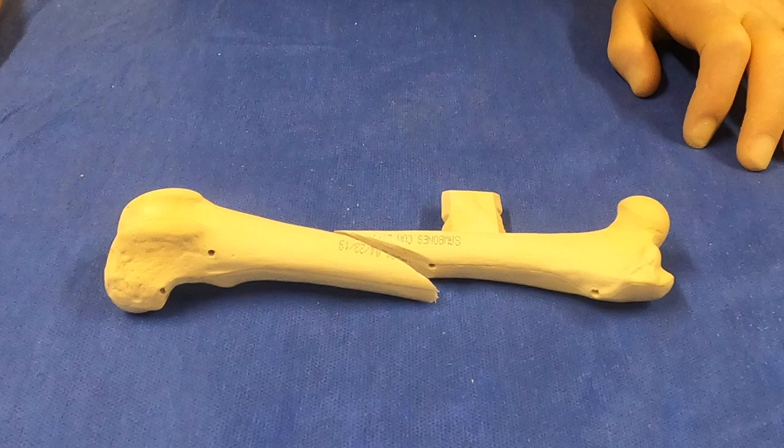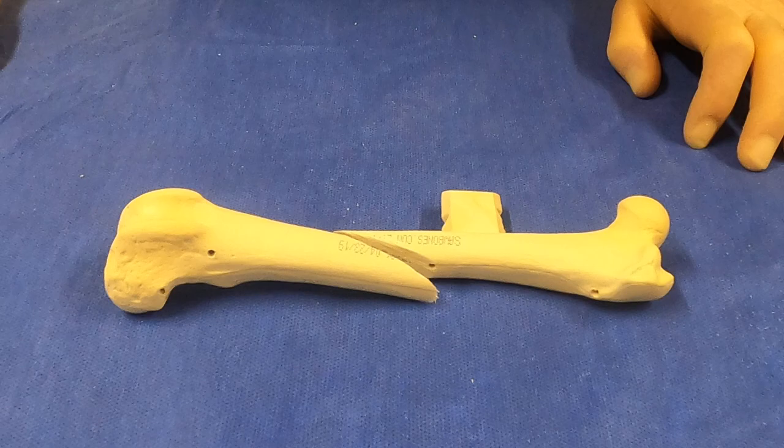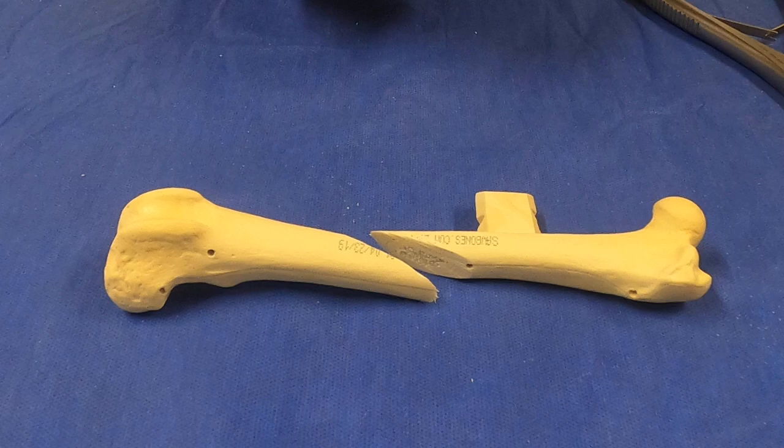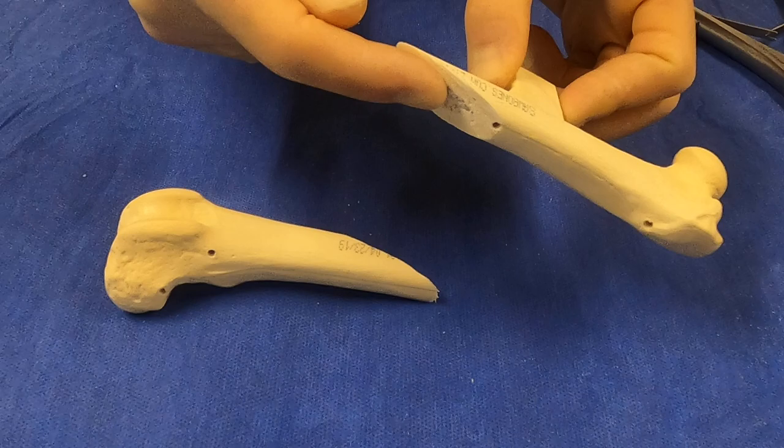When placing an IM pin in the SOP rod technique, we have two options. One is to place the IM pin normograde, which is from either end of the bone — here in the femur, we would do it from the proximal end. Or we can retrograde the IM pin, which is from the fracture site.